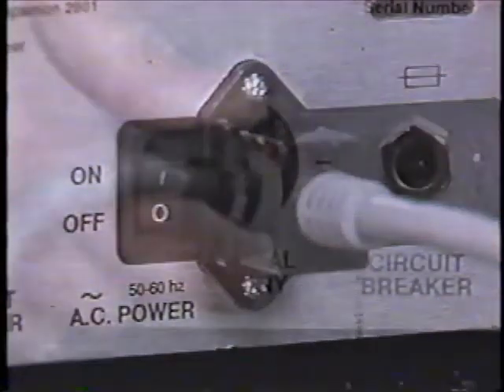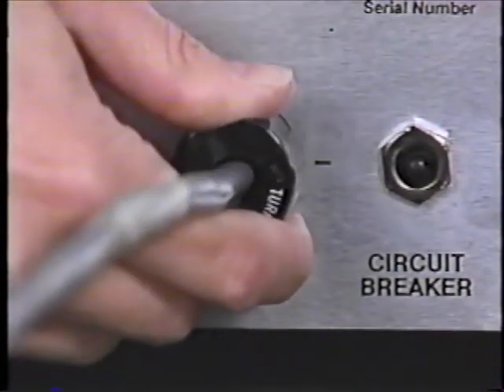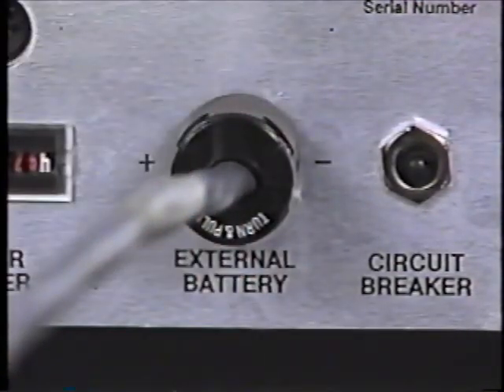An external battery cable is connected to the ventilator using the two-prong twist lock socket. Also housed on the back panel is the remote alarm socket. The companion remote alarm provides the same audible alarms as the ventilator and may be placed in remote locations. The hour meter shows hours of use. This is used to determine when the 6,000-hour periodic maintenance is required.